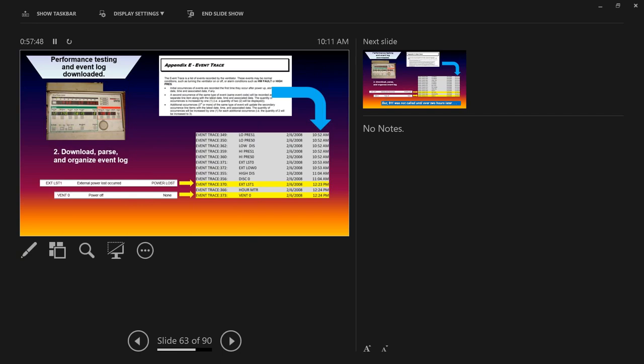And ultimately, I was able to download the event. Very tricky, very difficult process. Even the service manual did not tell you how to actually download the data into a terminal. It was almost like a secret internal document that I got. The biomed guy, from an old biomed website out there, even sent me a special cable. It was some funky RJ cable, wasn't an 11 or a 45, it was a DB9 serial cable that it needed as well.